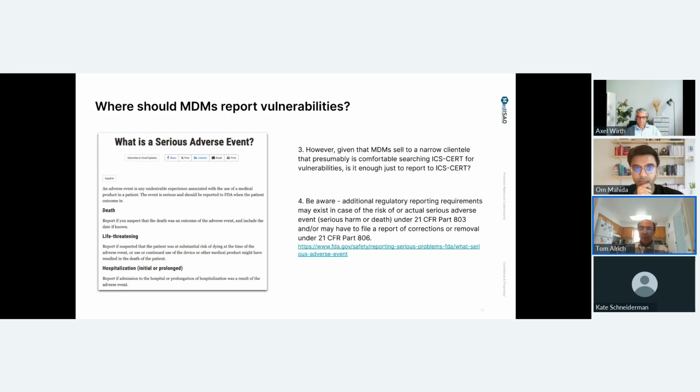Well, is it enough to report to ICS CERT? In many cases, I think it would be, because people can look in there. If they're looking for medical devices, they can look in there and they'll find vulnerabilities in different types of infusion pumps.